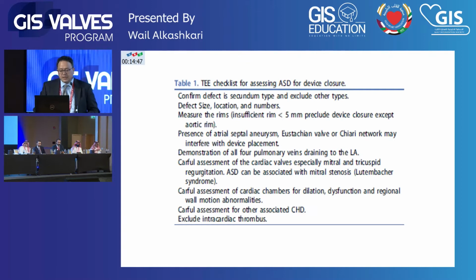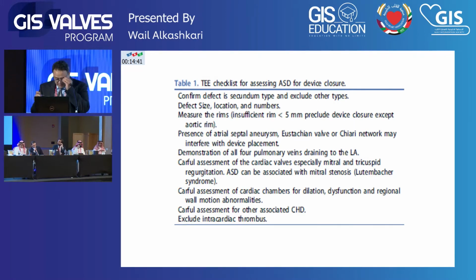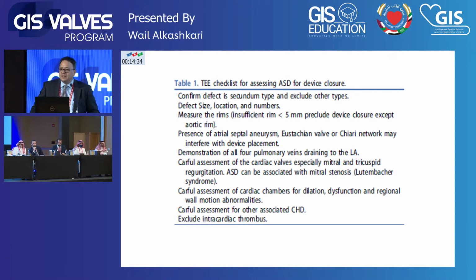I will take you quickly through the ASD, how to do and how to evaluate a complex ASD. I will make my talk based on examples, and at the end, if there is any question, we'll discuss it. So this is a classic picture table from any article you read about ASD.